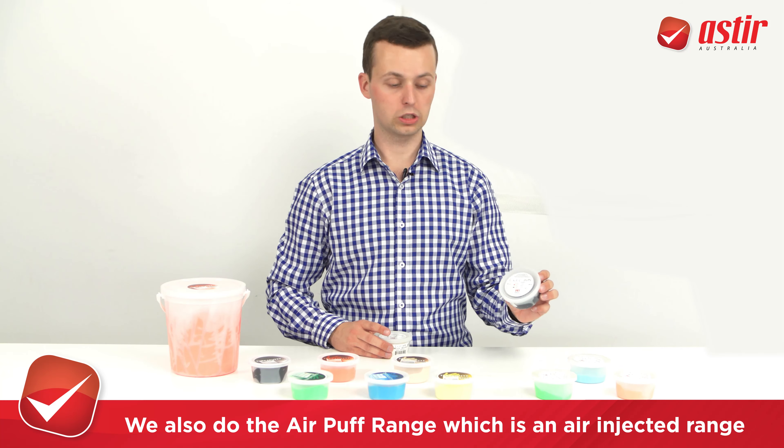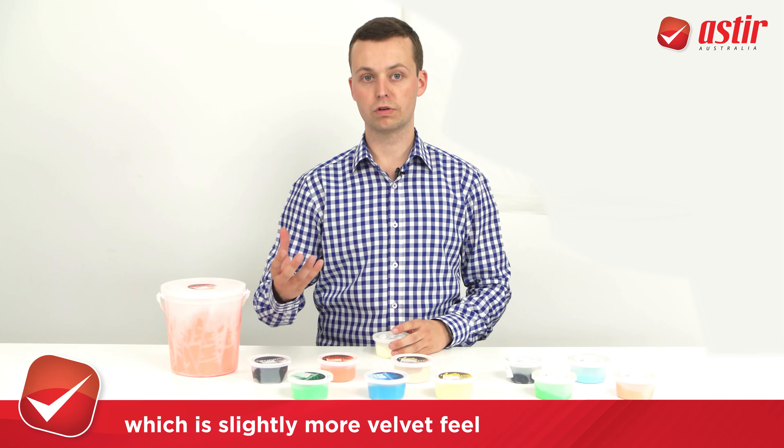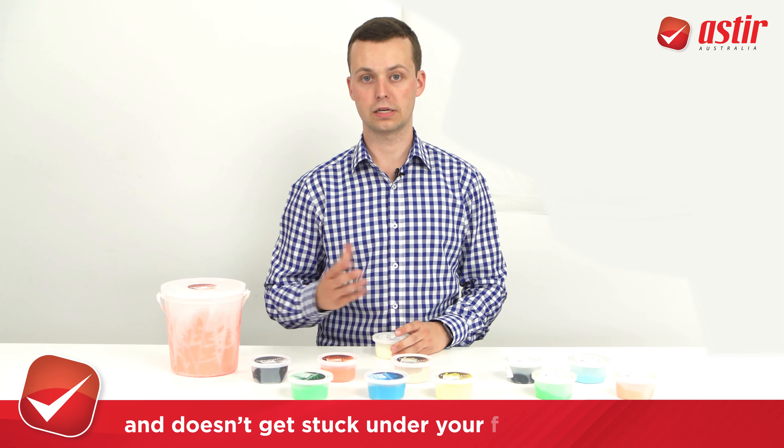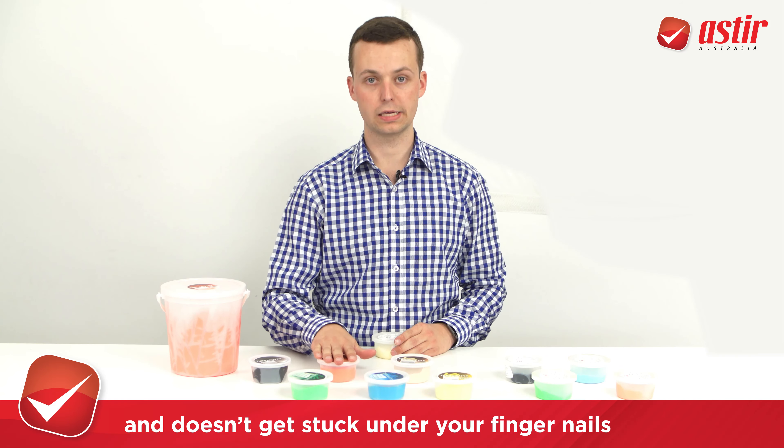They also do the puff range, which is basically an air-injected range which is slightly more velvet feel and doesn't get stuck under your fingernails or within your fingers, as opposed to your original putty.